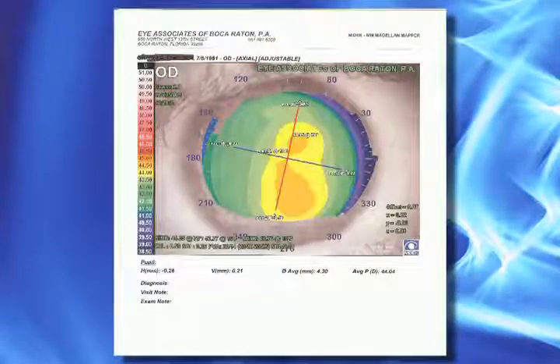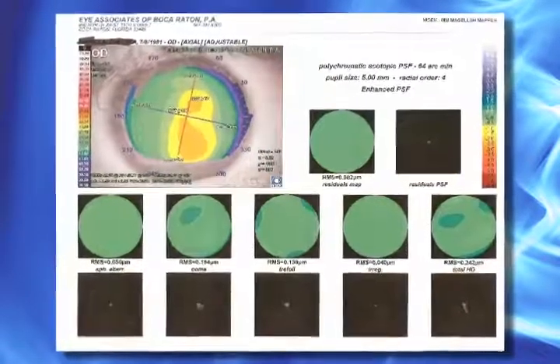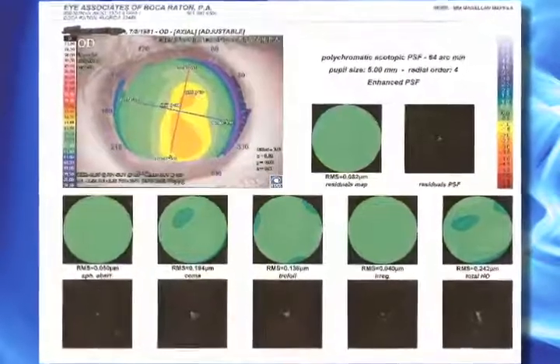There are two means of measuring the curvature of the front of your eye, as well as determining the underlying health of the cornea. One means is automatically included before cataract surgery. That's called keratometry. The other means is something called corneal topography. What you're looking at now is a printout of a corneal topography of a normal eye with a mild amount of astigmatism. The second page is something called corneal aberrometry, which shows the degree of irregularity on the surface of this person's cornea. In this case, it looks fairly normal, and we can predict a pretty good outcome.